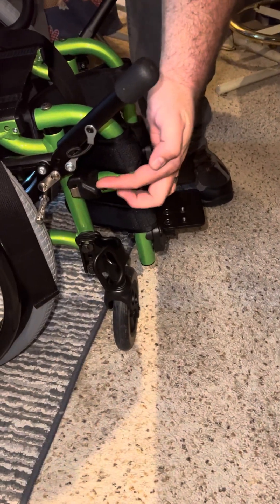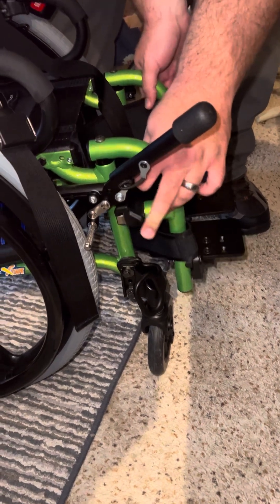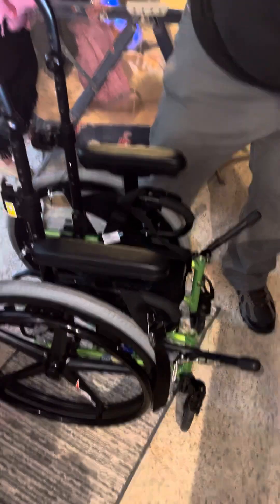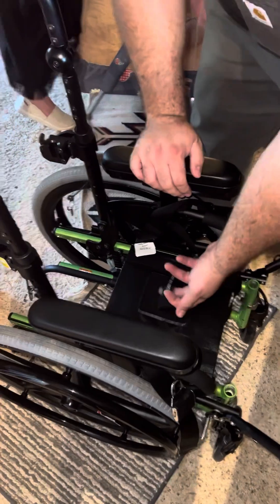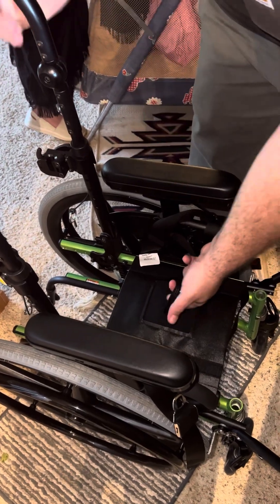Then you've got to take these off. There's a little thumb paddle down here — one on each side. You'll know it's pressed because it'll go from locked to spinning. Push to lock, pull to unlock.